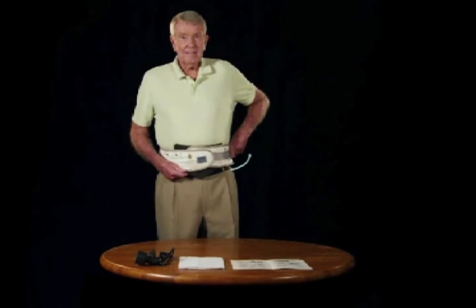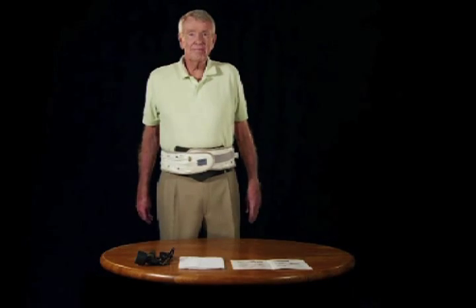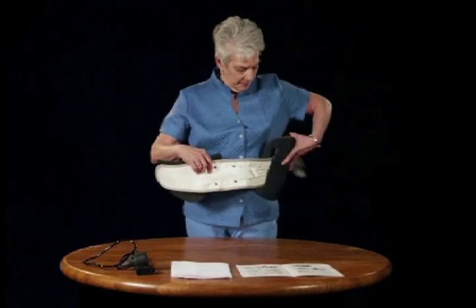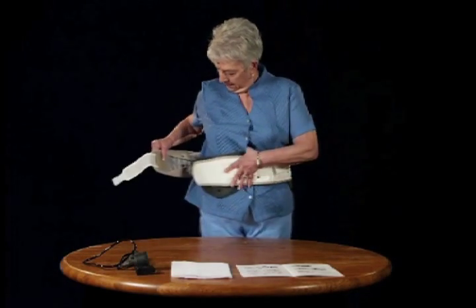Step 3. Tightly fasten the secondary Velcro strap. The belt should now rest precisely between your hip or pelvic bone and your rib cage. The device should be close-fitting, secure, and most of all, comfortable.